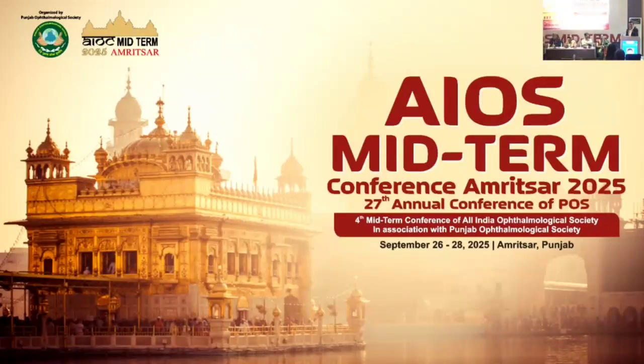It's very interesting, but OCT actually cannot pick up the suprachoroidal space. It is only in rare circumstances that with OCT you can pick up the suprachoroidal space.